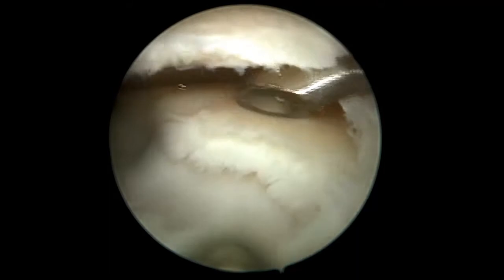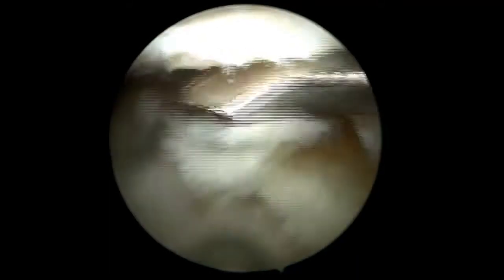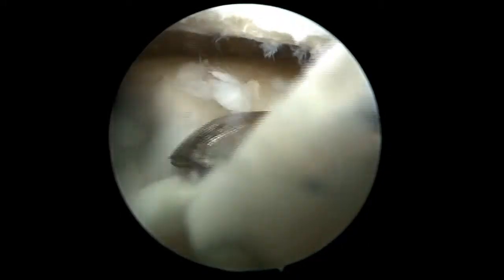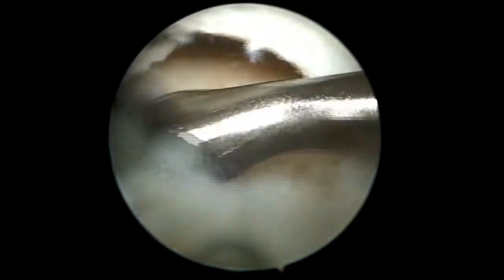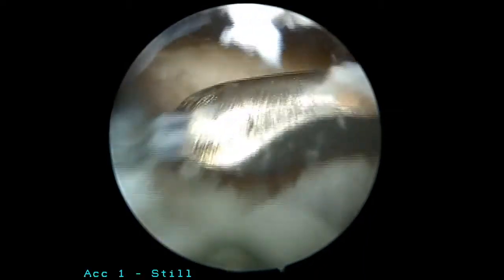The calcified layer is then debrided. A well-performed microfracture technique involves the creation of vertical walls, a complete violation of the calcified layer, and a spacing of holes 2-3mm apart, avoiding confluence to minimize trauma to the subchondral plate. Any undue trauma to the subchondral plate may result in ectopic bone formation that can negatively impact outcomes.